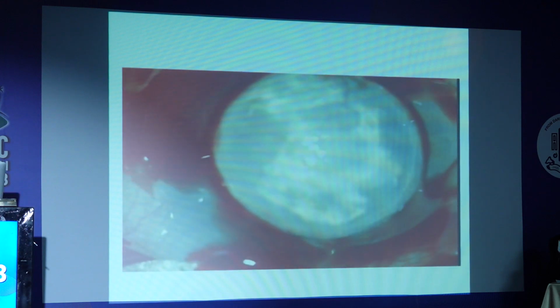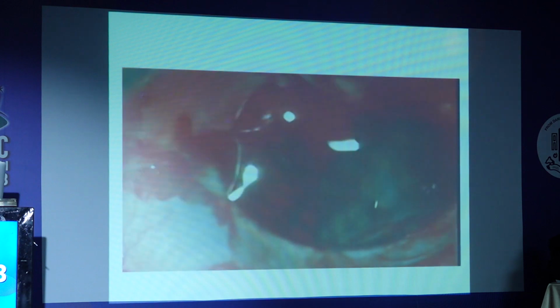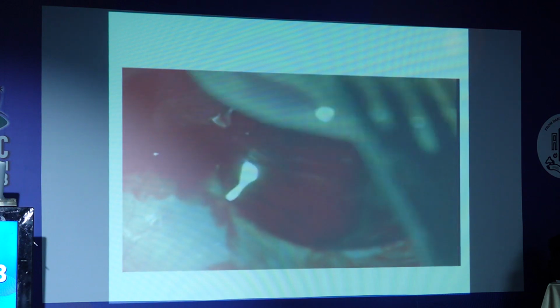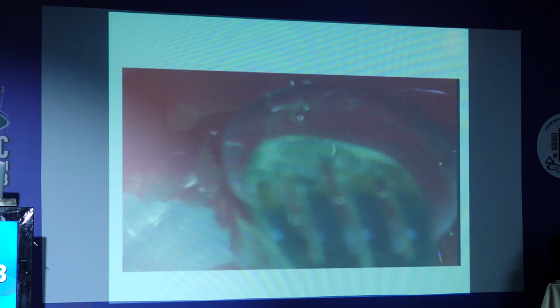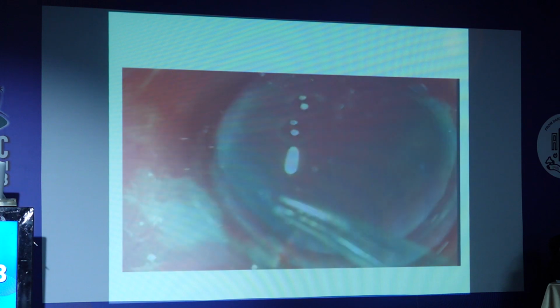Then I just put the same patient's cornea back and put a finger on that and waited for the bleeding to stop, having given intraoperative mannitol also. But the damage was done. And then I closed the eye. The pressure was so high, I was not able to suture with 10-0 nylon. I had to use silk sutures to close this patient's cornea.